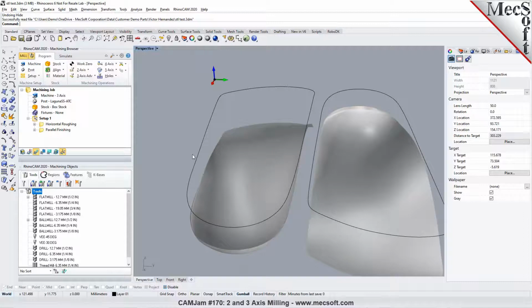Okay, you mean in terms of the XYZ placement? No, that's just for the design aspect of the mold. Okay, so you may want to talk to Rhino.